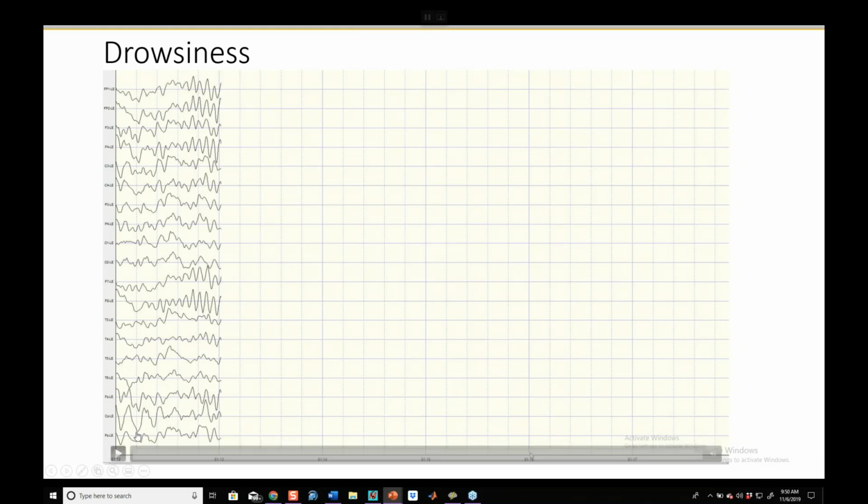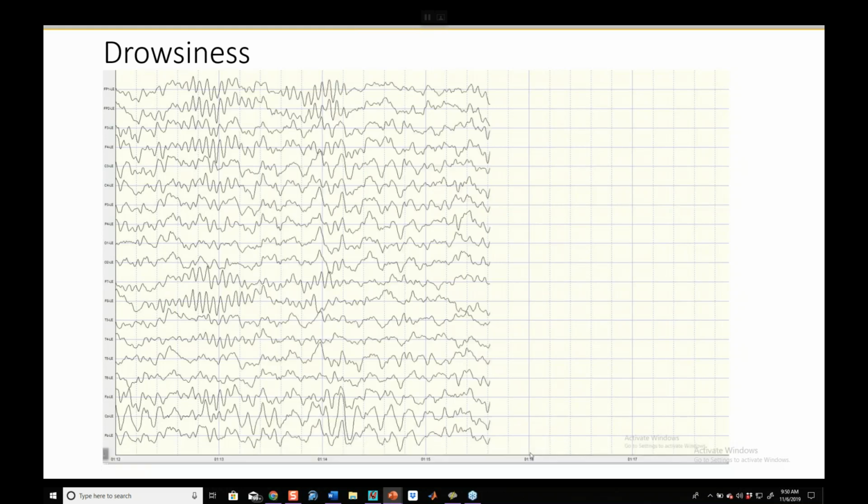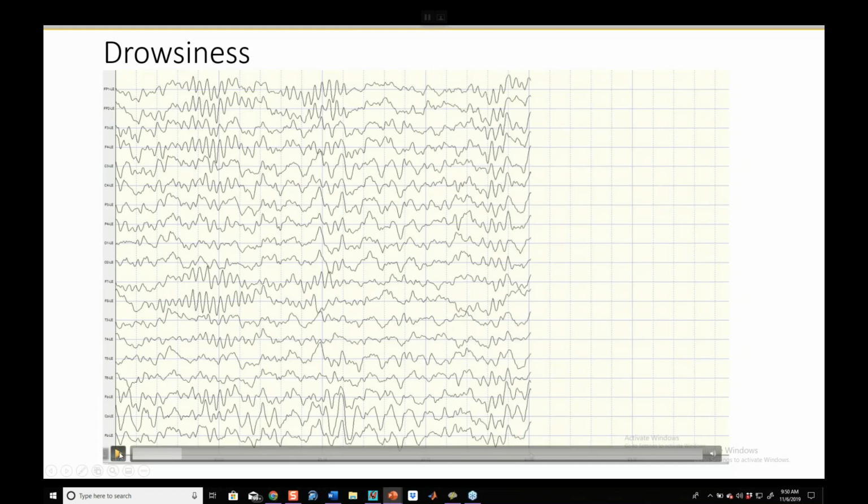And at 1 minute in, as we are here, what we probably have is somebody that either has sleep apnea or is severely sleep deprived. You'll find that if someone's falling asleep that quickly in your chair, that's what's going on. So I'm going to hit start. Now, right out the gate, I'm going to hit pause just so we can hold this slide.